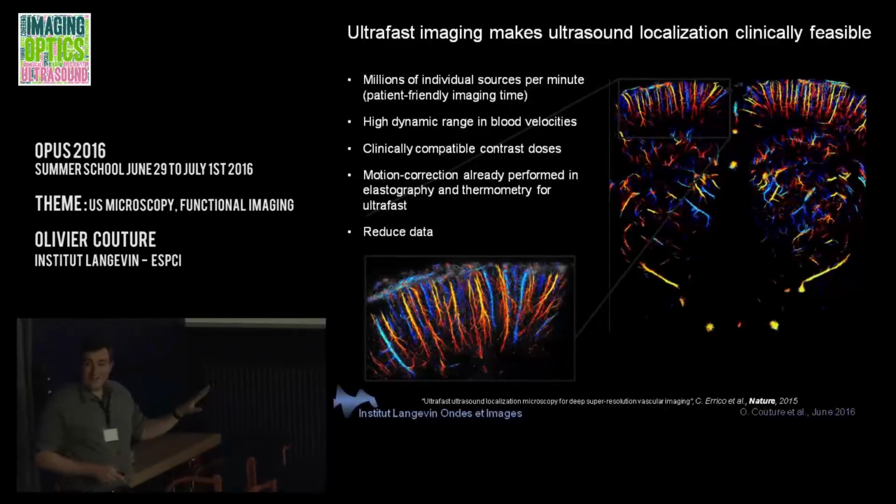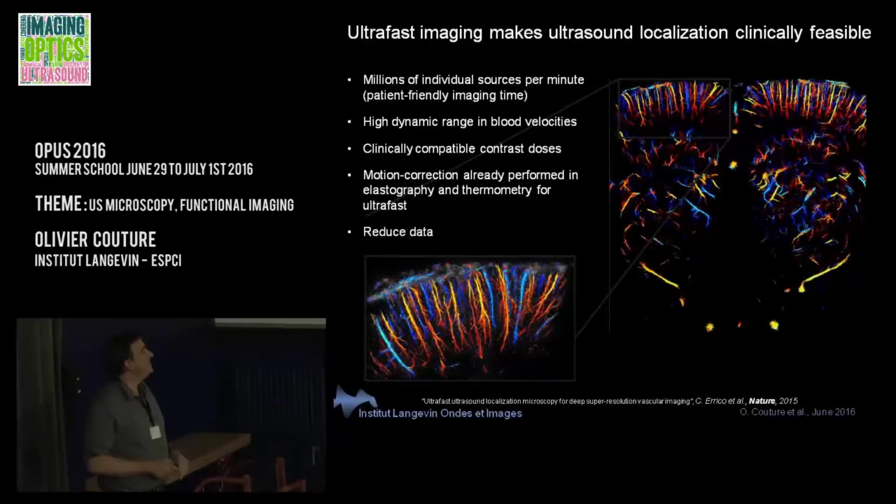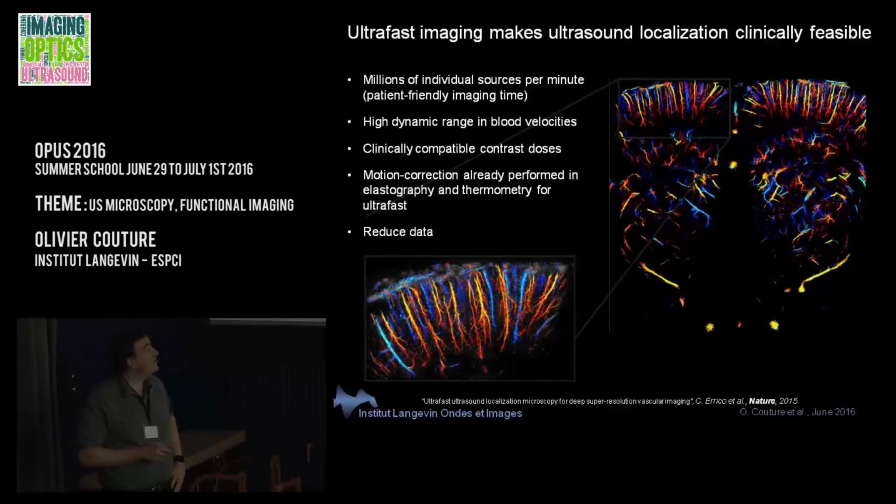It's also very nice because it's over a single plane. A coronal plane is very nice in this case. It doesn't move, so it's also very nice. And to answer your question about the heart, here is the biggest vessel in that slice. You don't see it. That's because of the filter, which extracts the vessels where the bubbles are too numerous to be distinguished from each other. So for the heart itself, it will be difficult, but for the myocardium, that will be possible.